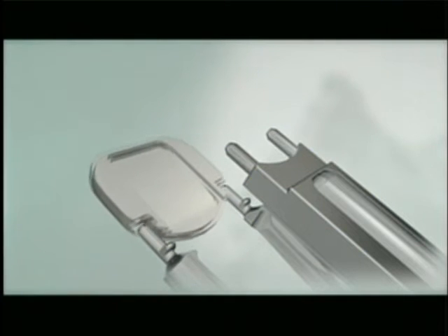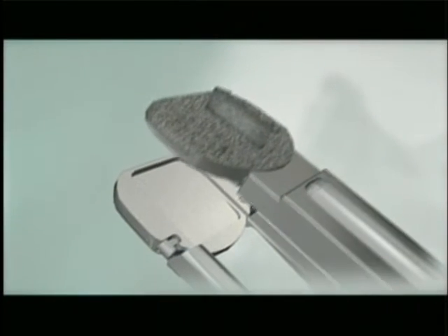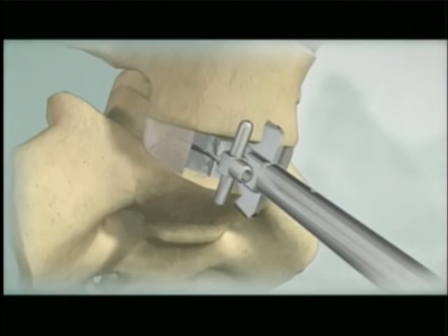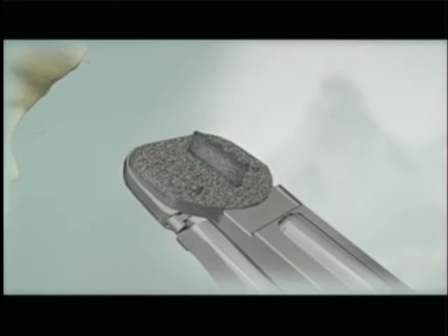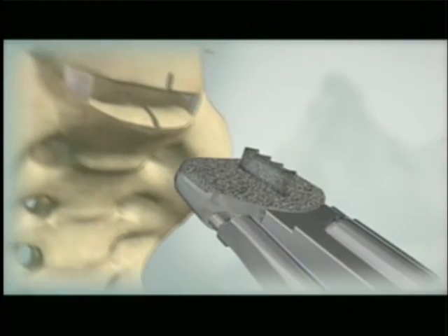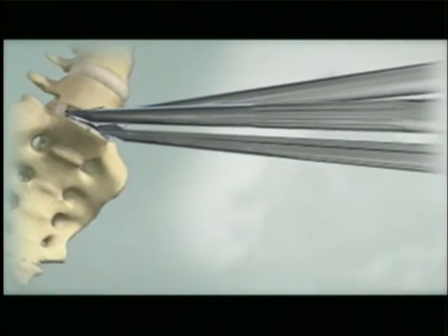Load the inferior end plate and superior end plate onto the inserter and nest the two end plates together. Remove the chisel and trial. Align the keels of the ProDisc L implant with the chisel cuts and insert the end plates to the posterior margin of the vertebral bodies.